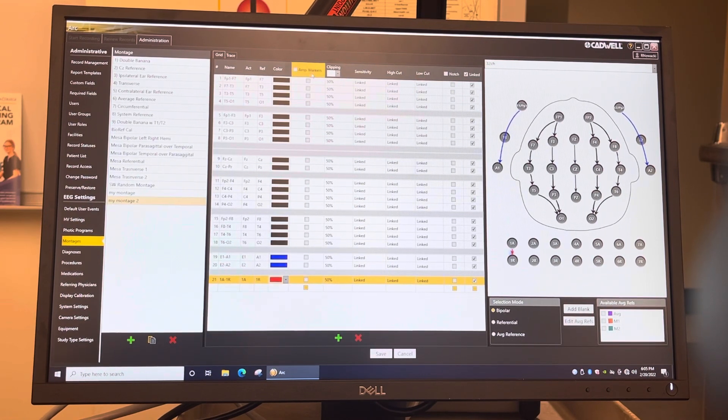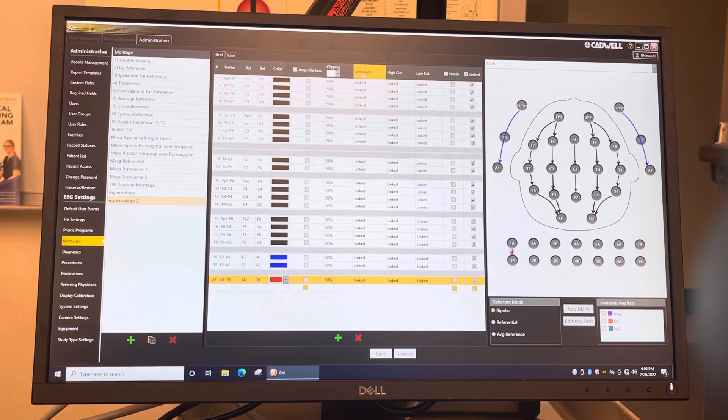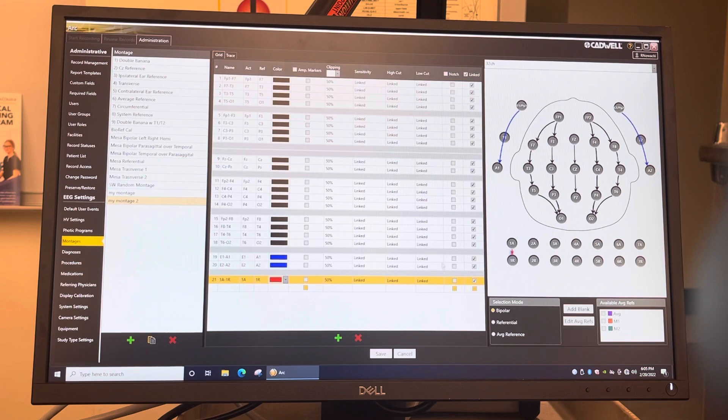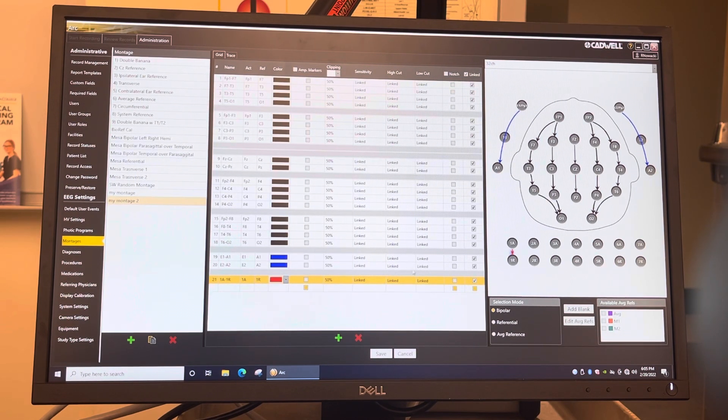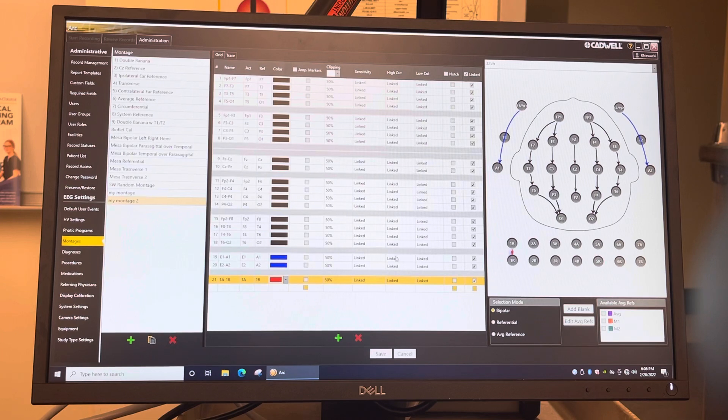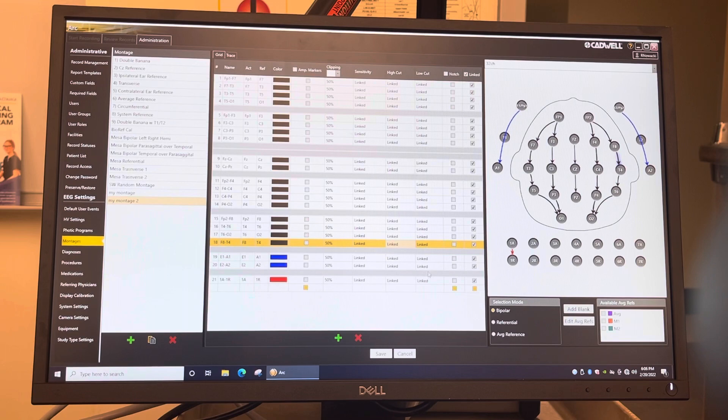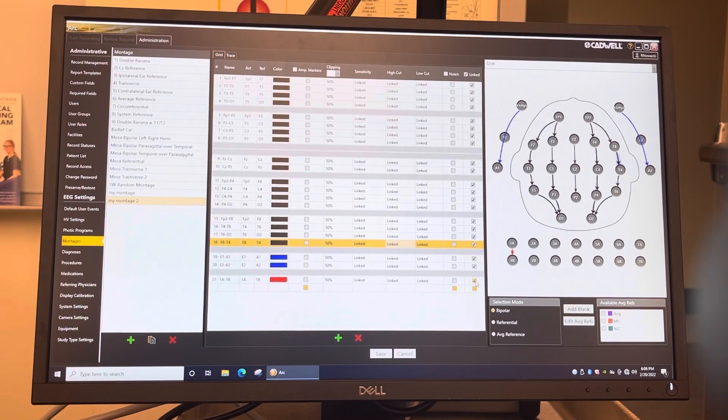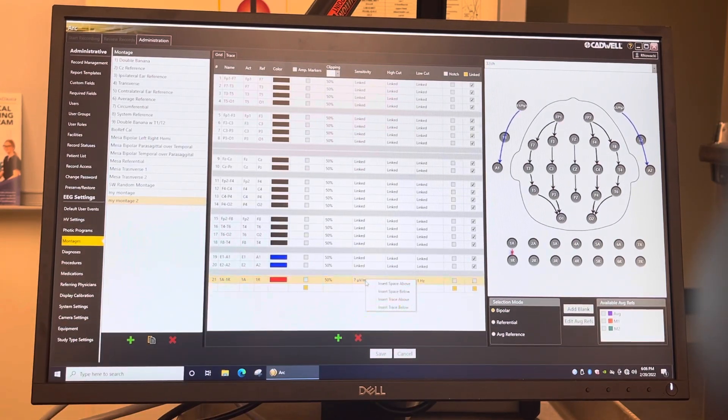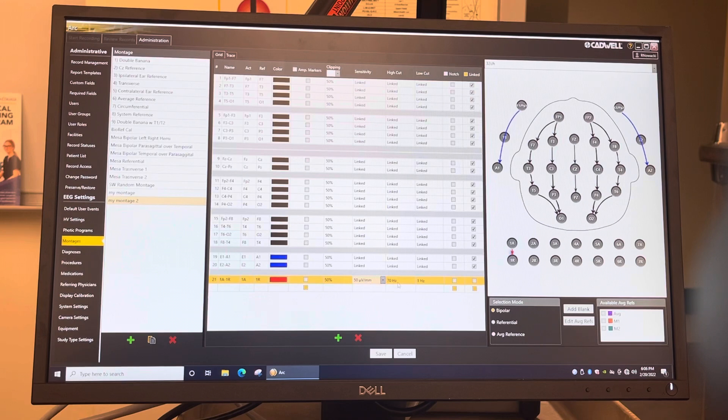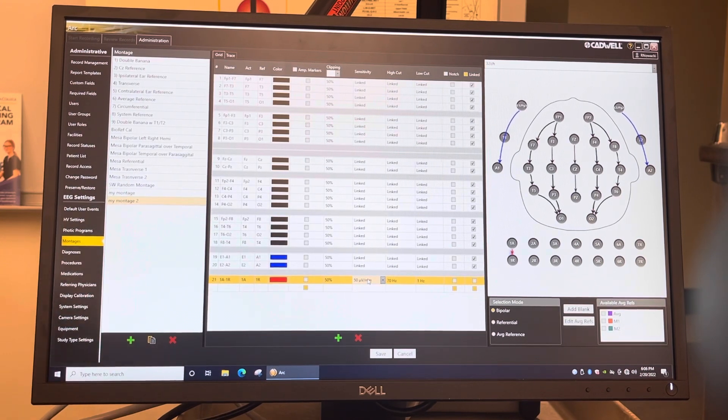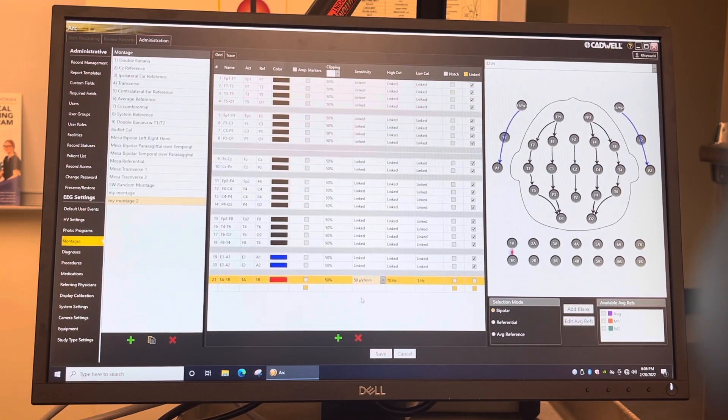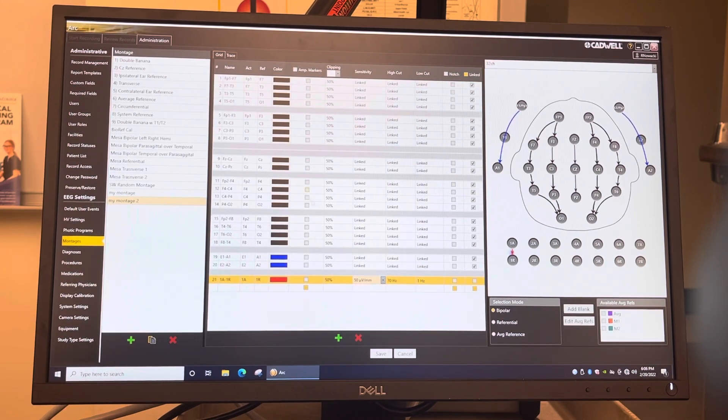Now if you look here on the sensitivity, the high cut and the low cut, they're all linked, and that's what you want. You want to have them all linked so they all show the same settings when you're recording. They'll all be seven microvolts per millimeter, 70 Hertz and the one Hertz for the low cut. But on the EKG, we're going to take the link off down here because we're going to make this 50 microvolts right there. Because if you have it on seven, it's going to be really big because it's so close to the heart. The EKG is going to go up into your tracing, so we're going to make that 50.